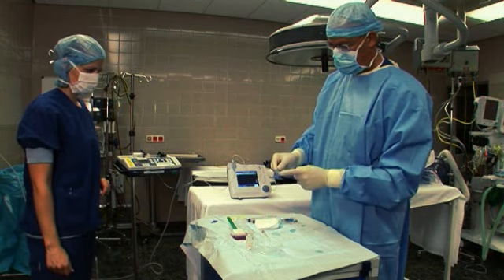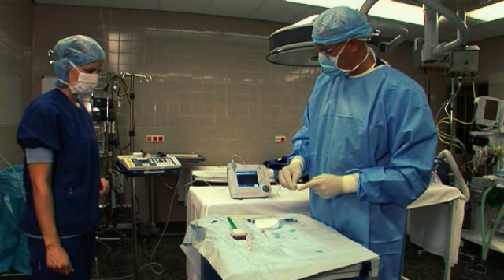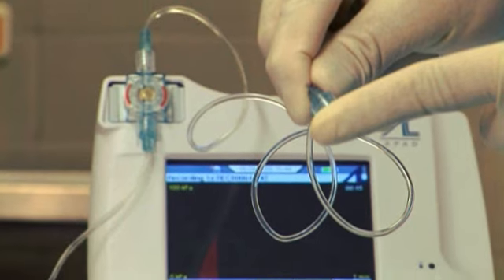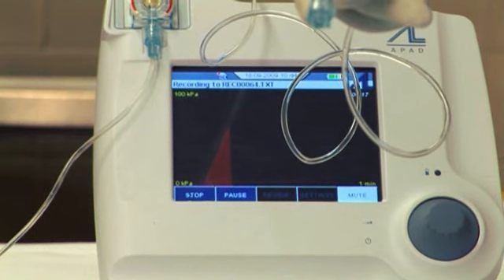The anaesthetist occludes the disposable with his hand while the pump is running. As a result, the pressure in the tube increases, and therefore a rise in tone pitch should be heard. Besides this, the increase in pressure should be visible on the monitor.